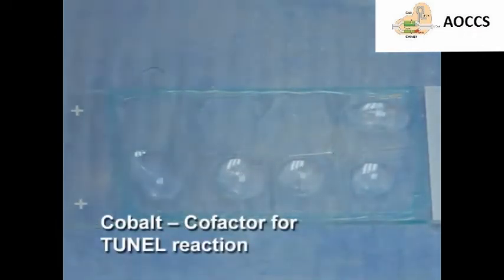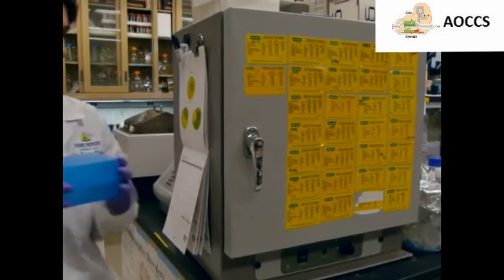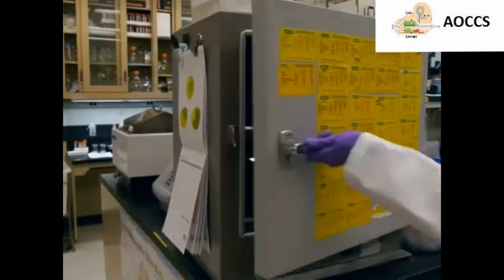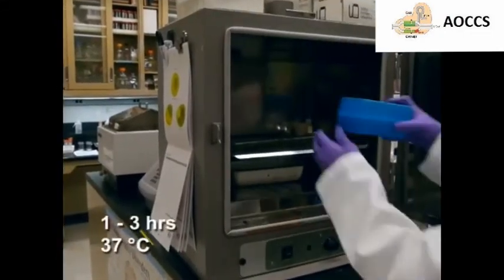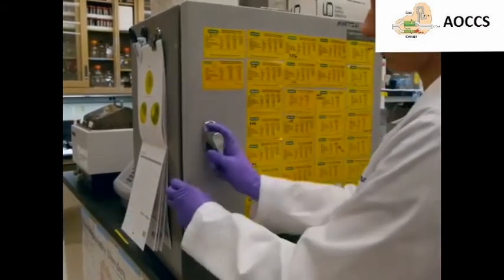Following permeabilization, the TdT enzyme and fluorescently labeled dUTPs are added to the tissue sections along with a labeling buffer containing cobalt that acts as a cofactor for the TUNEL reaction. Together, the TUNEL reaction mixture and the tissue section are incubated for 1 to 3 hours at 37°C and protected from light to prevent the fluorescence from fading.